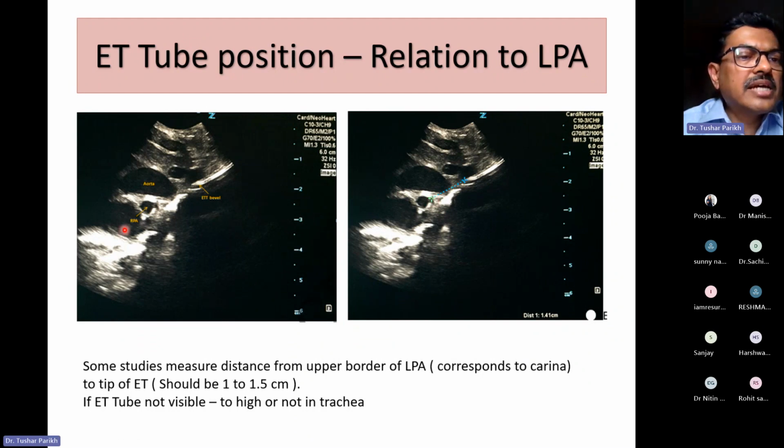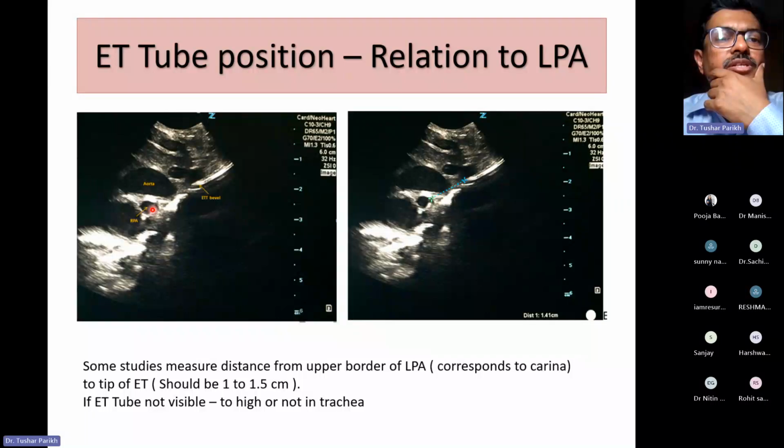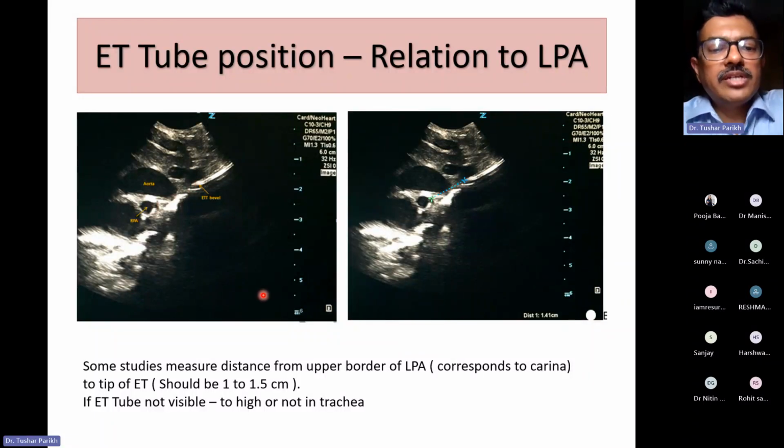So I think by mistake it is the RPA. Actually, it is LPA, because this image will get only on a left pulmonary artery. So basically the distance is from the upper surface of the left pulmonary artery to the endotracheal tube. So this distance, if you measure, it should be 1 to 1.5 centimeter.